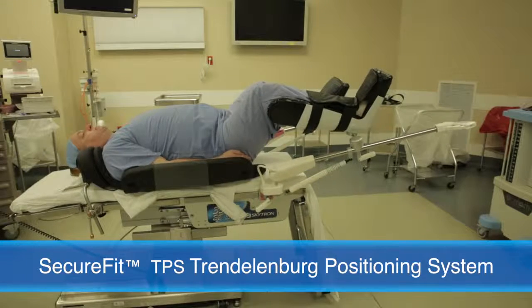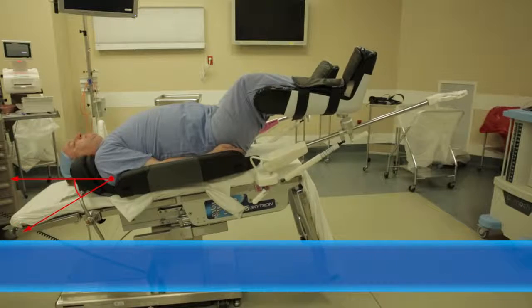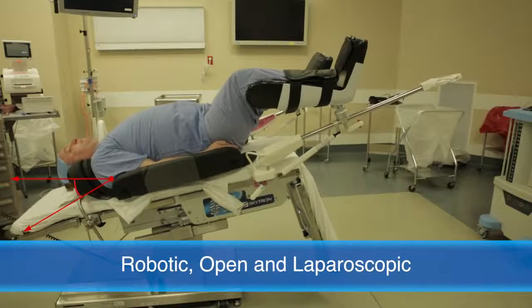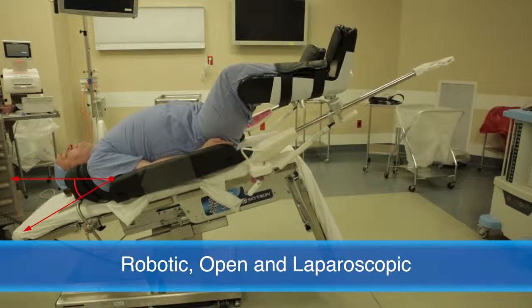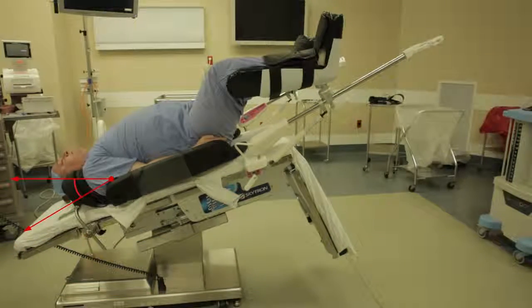Flexible and adaptable, the SecureFit system can accommodate patients up to 400 pounds for a variety of Trendelenburg surgeries, including robotic, open, and laparoscopic procedures, including steep Trendelenburg.